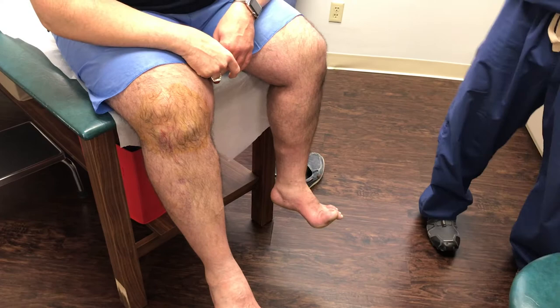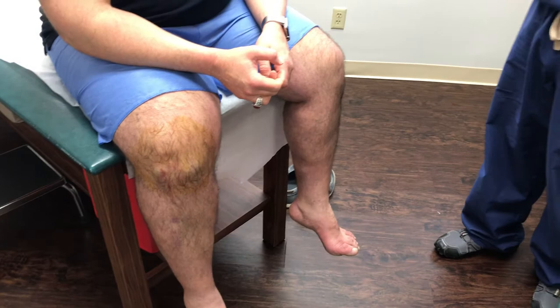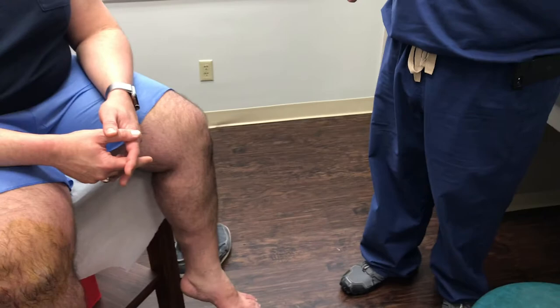The technical term is we raise a wheal. We want to deaden that whole area of the skin because the skin has more nerve endings than anywhere. And then deaden as we get down to the joint capsule. In your case we're going to do both areas because we're going to look on both sides of your knee.